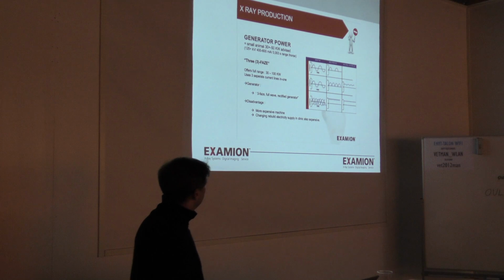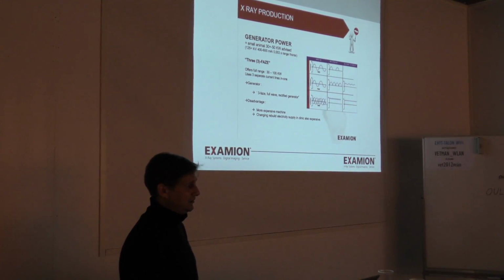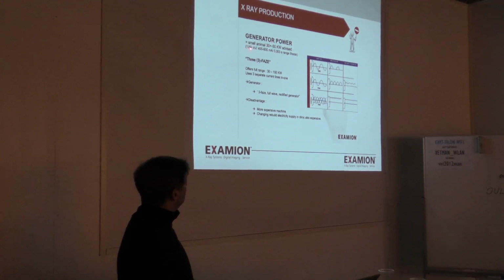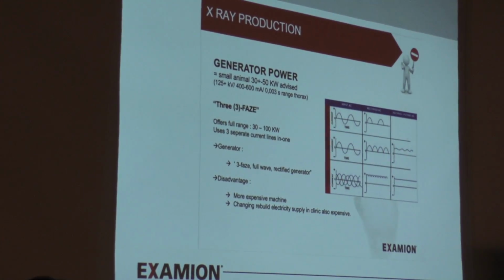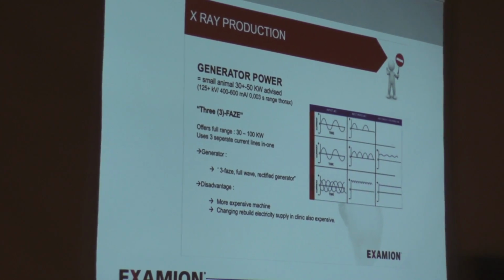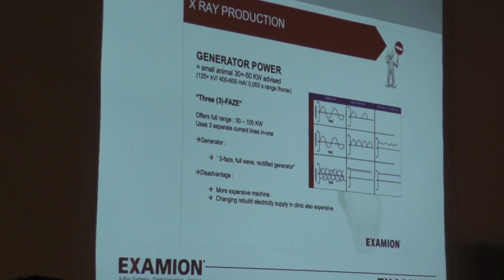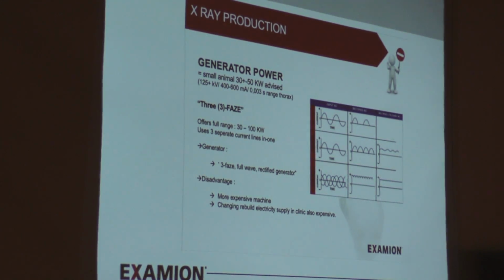Now, very shortly on the X-ray machine. In the past, powerful X-ray machines needed lots of power. As you see, we are talking about machines of 125 kilovolt, 400 to 600 milliamps. These were like standard X-ray machines with which you could actually X-ray all dogs, and all cats of course, but dogs are the most difficult, also larger ones. Also hip dysplasia from very solid, muscular dogs.